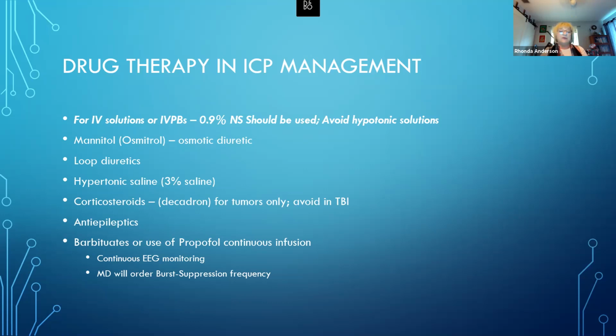So they want to see pretty much flat lines on everything, but every 10 seconds, we want a little burst of brain activity. So we'll just see boom. And you don't have to be certified to do this. The text can show you on the screen, which areas at 10-second strip so that you know where to be looking to monitor that. But this, again, you might see this used for subclinical seizure management.